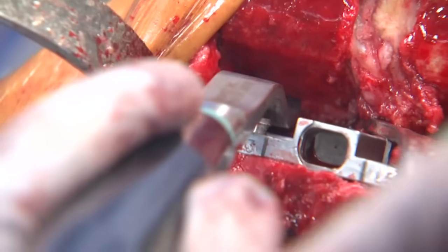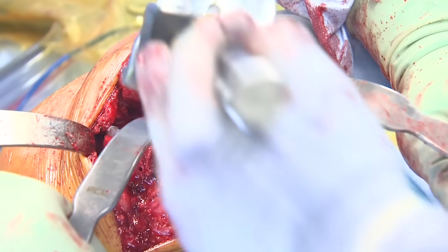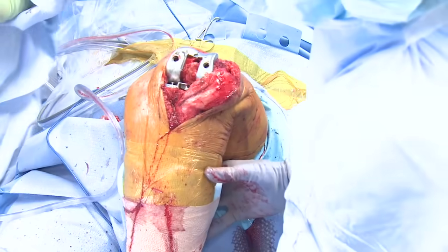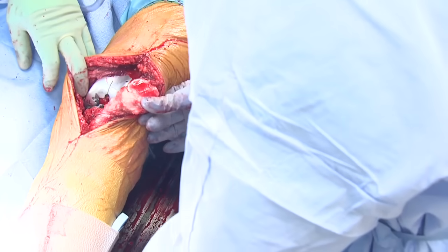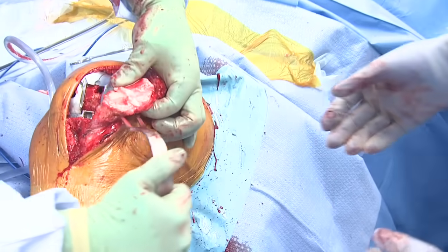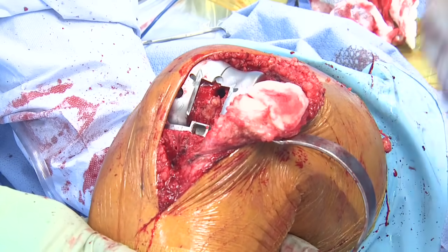With the proximal tibial tray in place, posterior osteophytes are removed from the distal femur. The femoral trial is then applied. The knee is brought into extension and the patella is then everted to allow for appropriate resurfacing. A retractor is then applied to assist with eversion of the patella as well as stabilization. Extra proximal and distal soft tissues surrounding the patella are addressed appropriately.